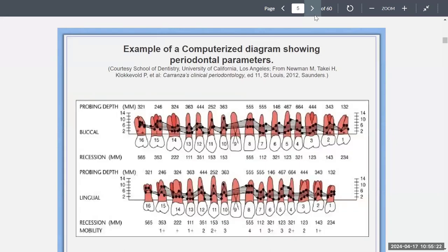There's a computerized diagram that shows you the periodontal charting. You can see the dots and the probing depth when they call out the probing numbers. You can also see that there's recession, with numbers listed for recession, and mobility listed as plus 1 or plus 2, indicating how mobile a tooth is.